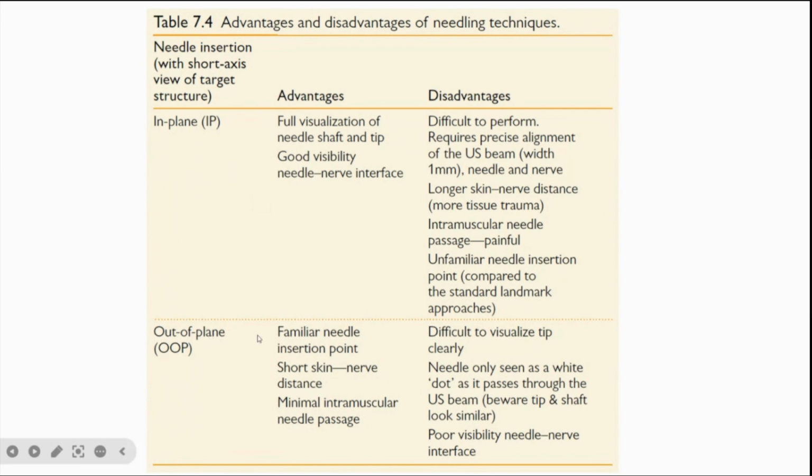The out-of-plane technique has a familiar needle insertion point and a short skin-to-nerve distance. But it often requires a higher degree of skill to visualize the needle tip clearly. So the needle is often only seen as a white spot as it passes through the ultrasound beam.